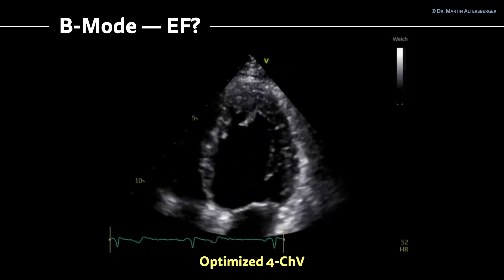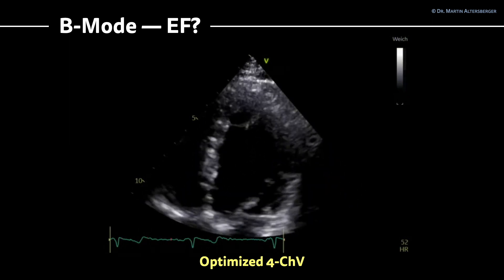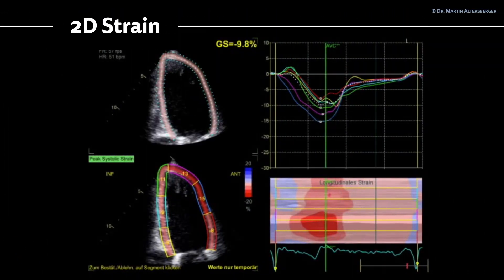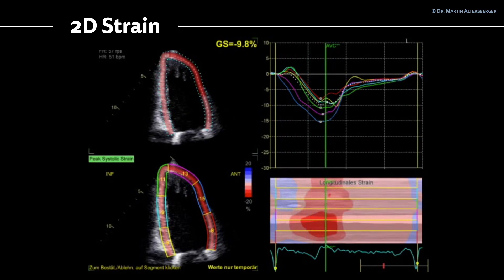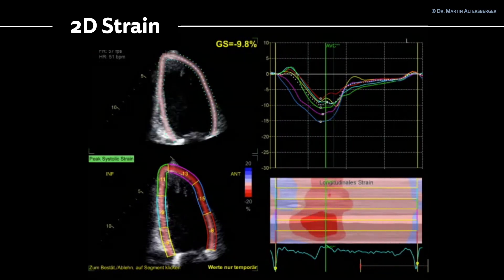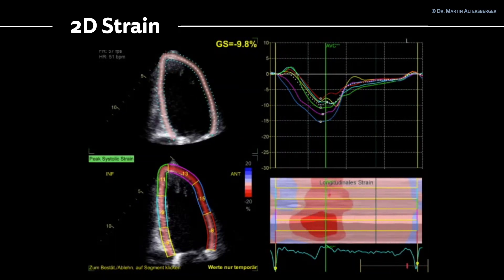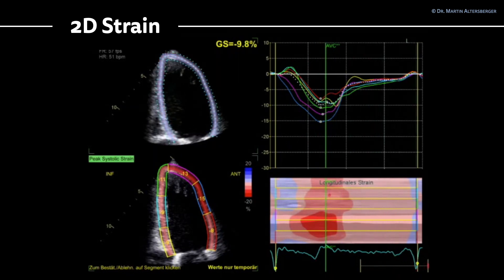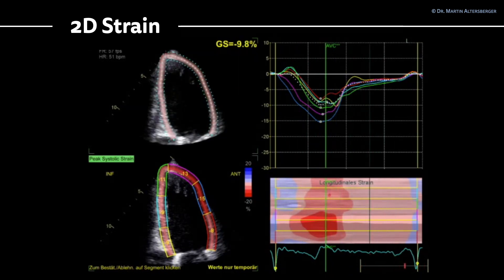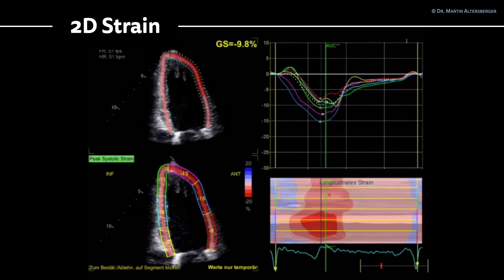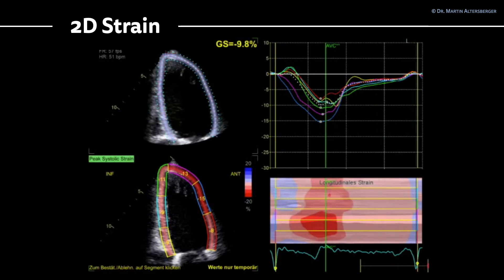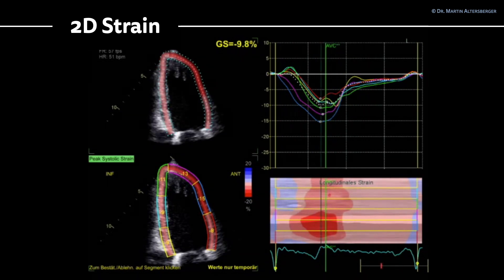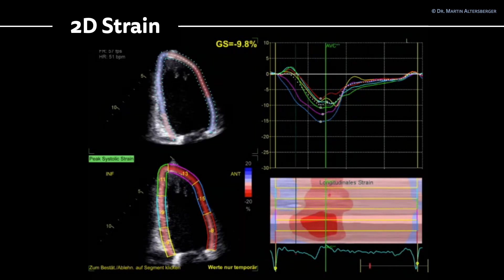In this case you have an even better appreciation of the left ventricular apex. The strain imaging was also reduced. Both modalities — the B-mode image and the strain image — show reduced function of the left ventricle. The global strain of the two-chamber view is only minus 9.8 percent.